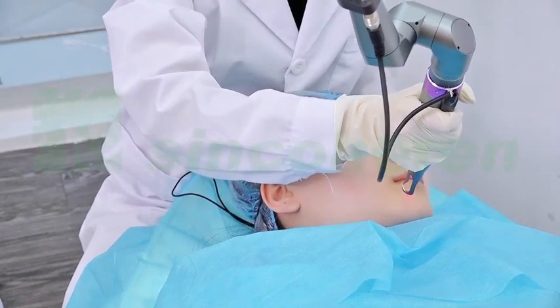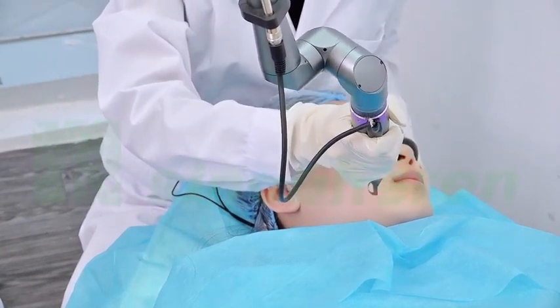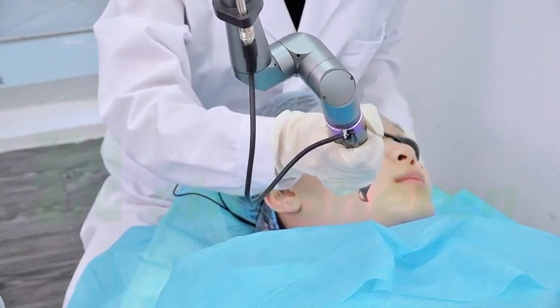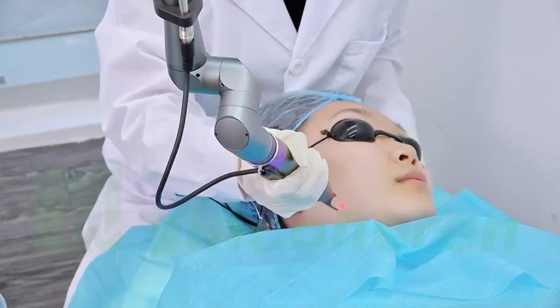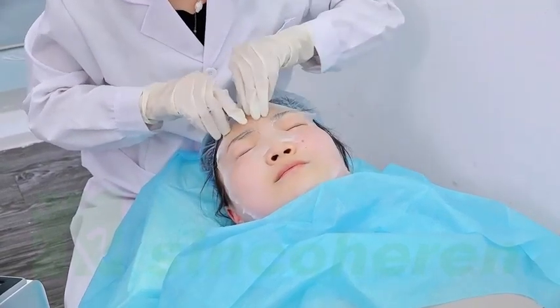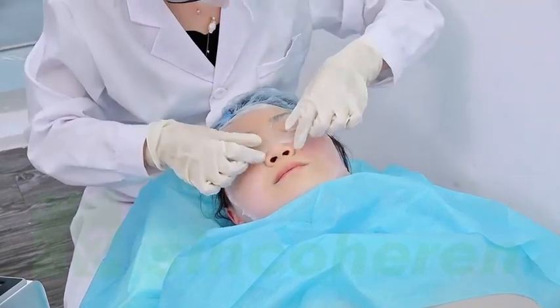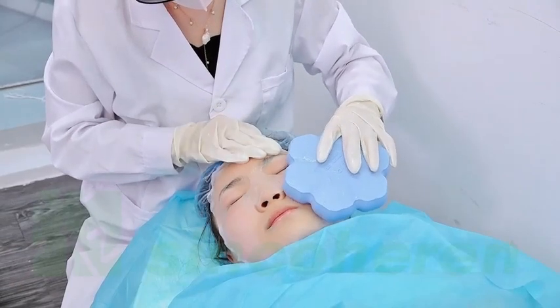Vertically or circle scan from bottom to top, from inside to outside. A slightly red skin or warm feeling is the treatment endpoint. Scan the whole face 1 to 3 times. After the treatment, use mask to hydrate, cool, and smooth the skin.